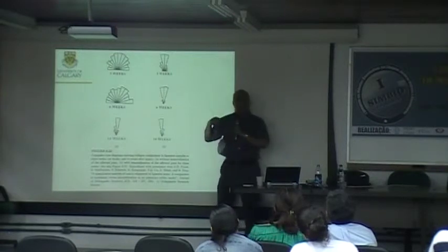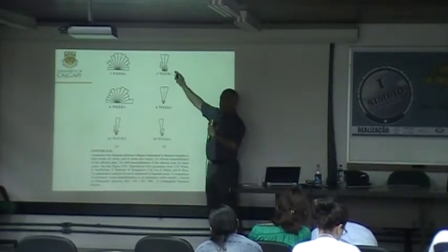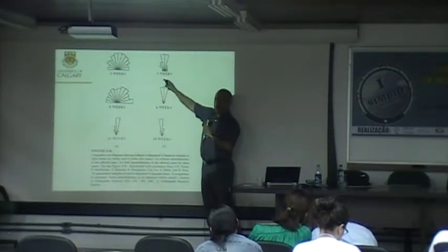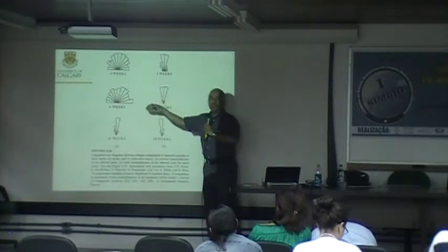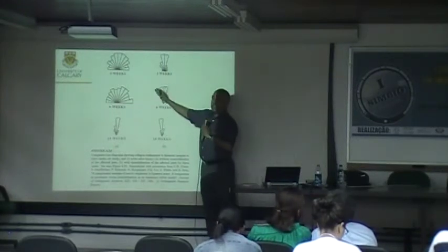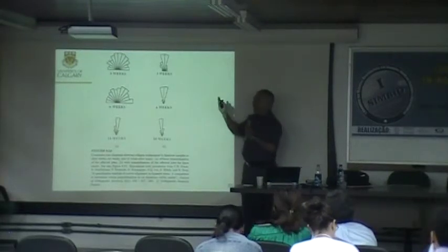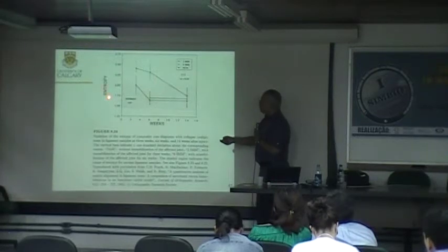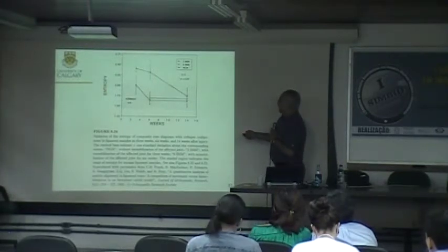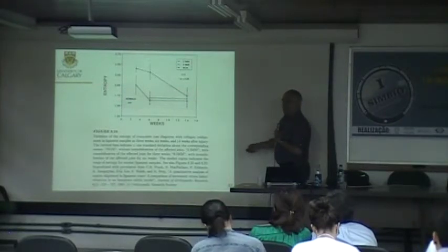So this is quantitative analysis. We can derive numbers. We take, normalize this, get the entropy. This is a probability density function. Variation with angle. We don't care what the angle is, but we want the dispersion. So what is the variance or entropy? And this is entropy. So this is the normal band. There is a large band for normal, 1.5 to 2.